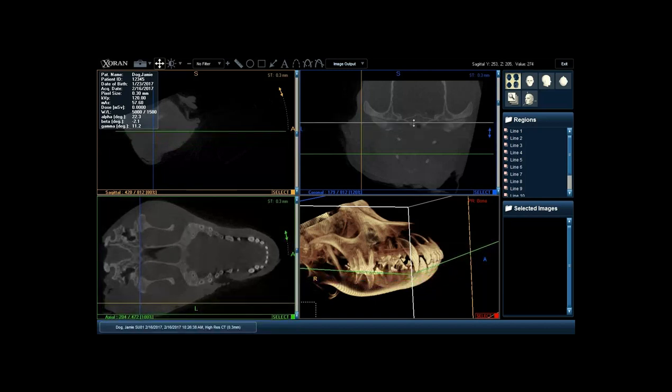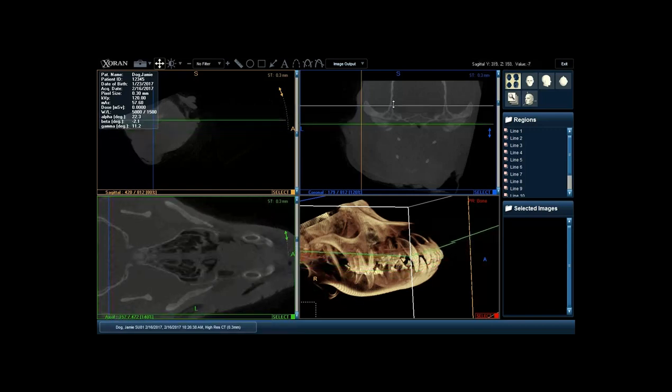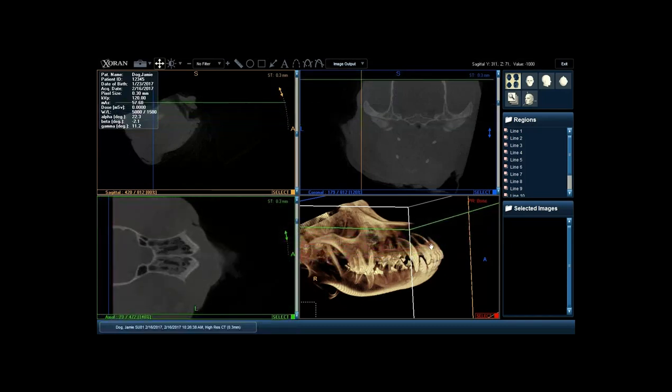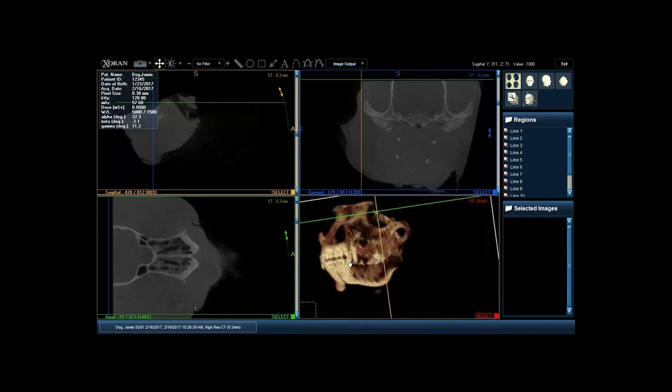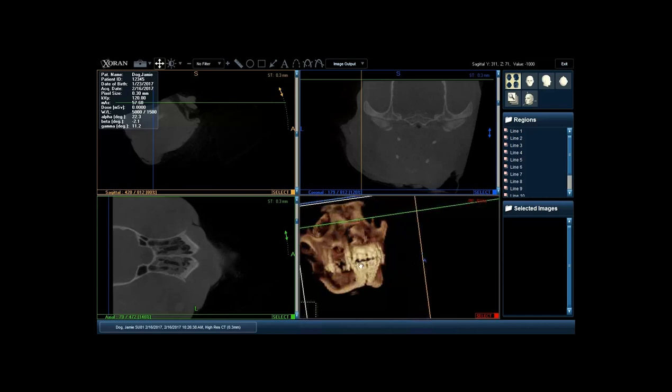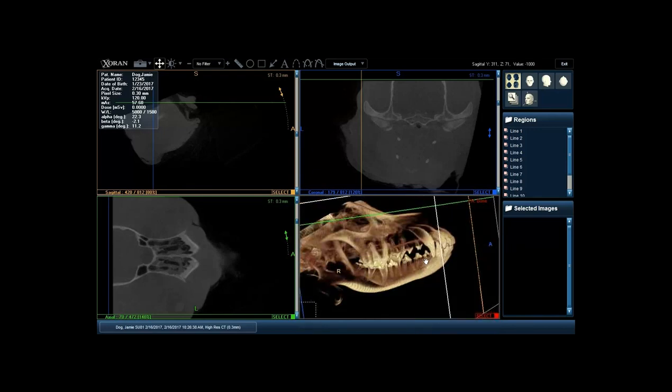Going back up, we can identify that interproximal groove, and you can see that the distal root was on the lingual aspect of M1 on the axial view. This is especially helpful for brachycephalics where we identify maxillary premolar and molar root position. You can see the interproximal groove on the distal roots of the upper fourth premolar bilaterally - you can visualize that very distinctly in the axial view. Then going all the way up gives a thorough view. The 3D reconstruction is very neat for certain instances, but as far as routine diagnostics, the three standard views are going to be the most important.